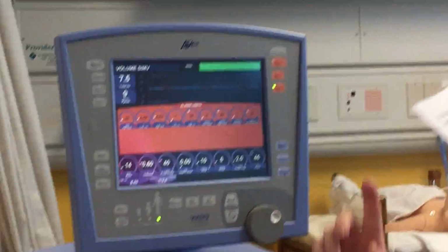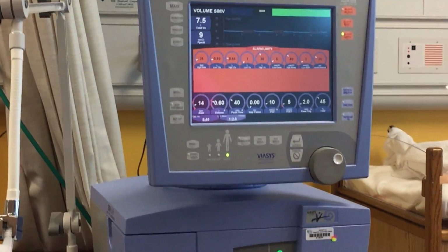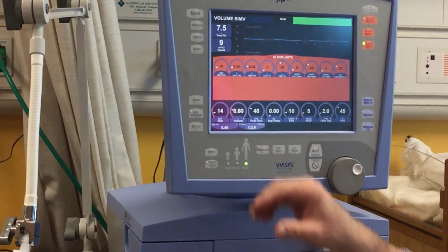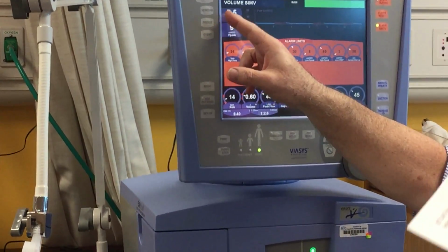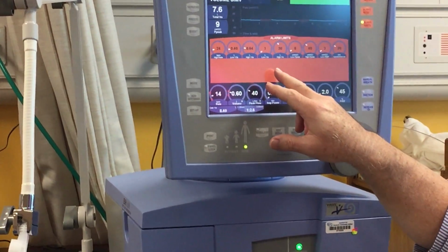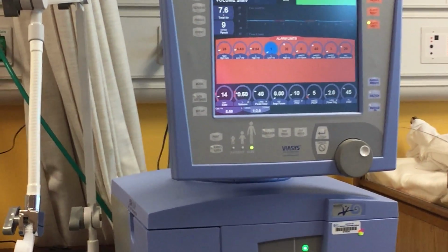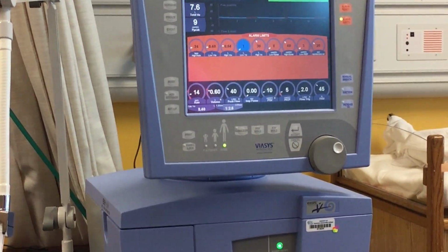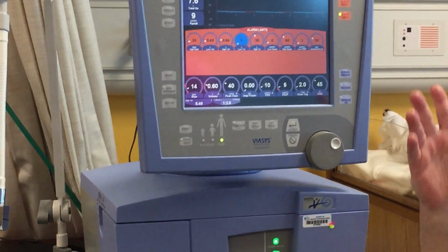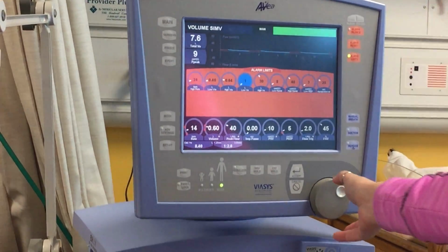So, rule of thumb, when you set your minute volume, is you're going to go 1 liter above, and you're going to go 1 liter below. So, if our exhaled minute volume is 7.5 liters, what am I going to set my low VE at? 6.5 or 6.6? You have to go whole numbers on this. So I'd probably go 6. So set it at 6 for us, please.